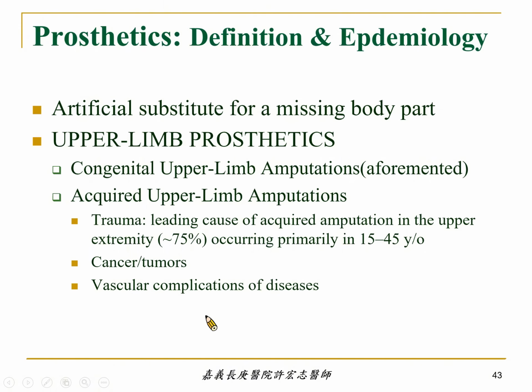Now we are coming to prosthetics. The definition of prosthetics is the artificial substitute for a missing body part.